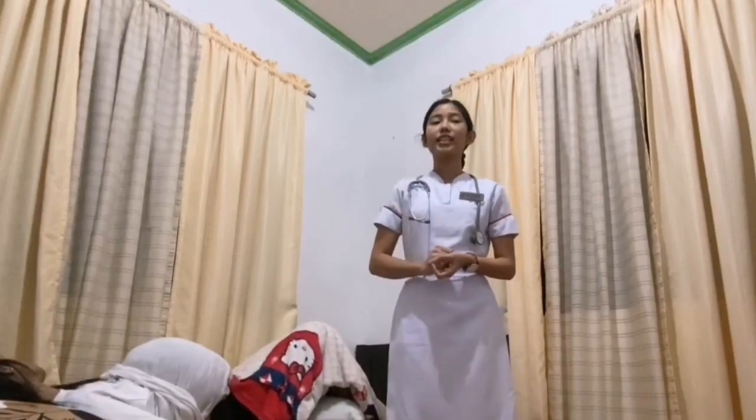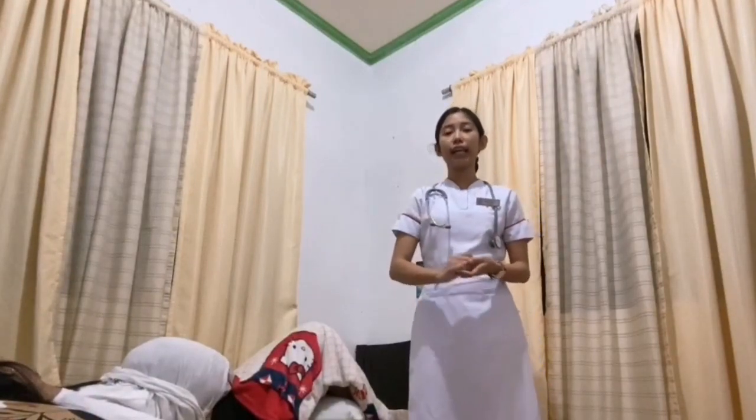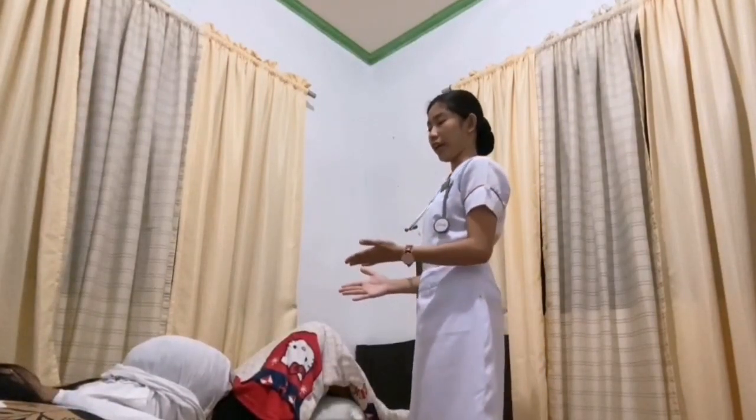So the next thing is, if right-handed, stand at woman's right facing the patient for better accessibility of the healthcare provider. So in this case, I am right-handed and this is the right of my patient. The next thing is to proceed with the first maneuver or the fundal grip.